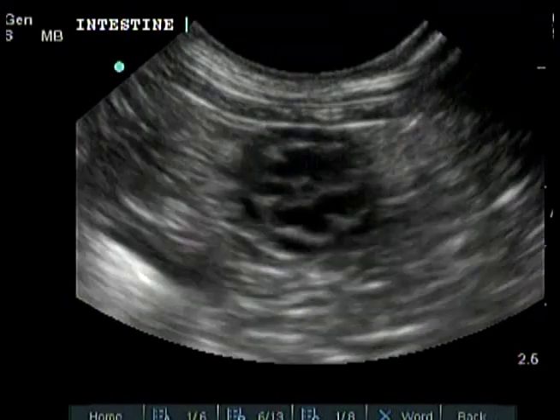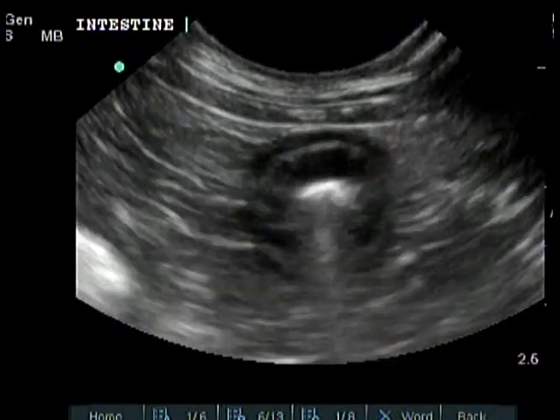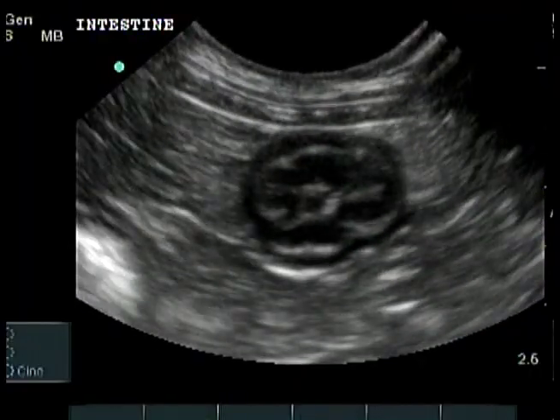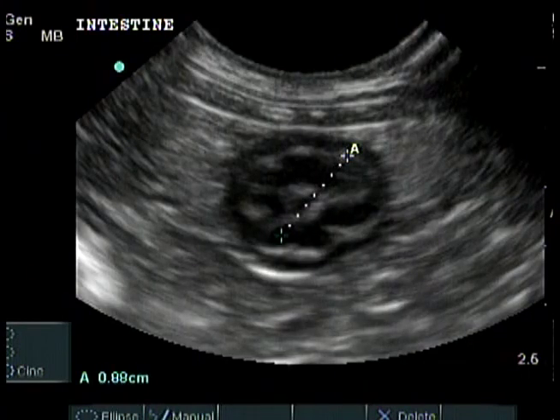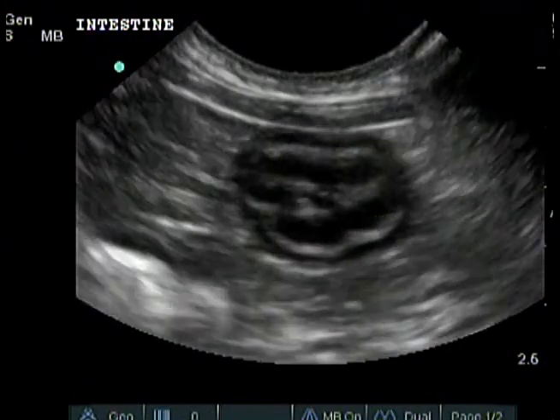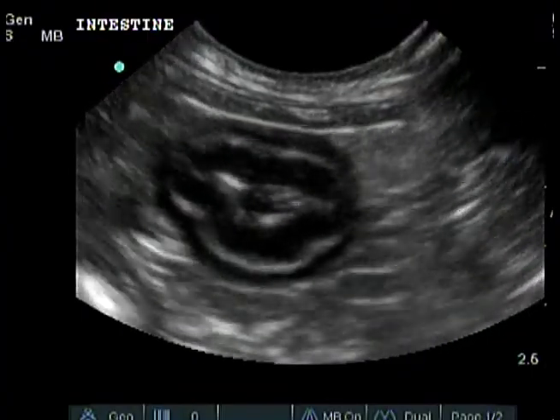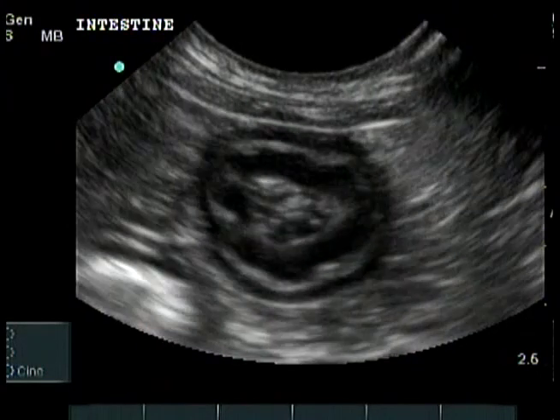The canine cecum is found in the right mid-abdomen and not frequently seen. The cecum is usually found by accident when it is empty, because it does not look like the other intestines. The empty cecum looks like a pouch consisting of multiple invaginations similar to rugal folds of the stomach. When filled with fecal material, it is very difficult to differentiate the cecum from the ascending colon.